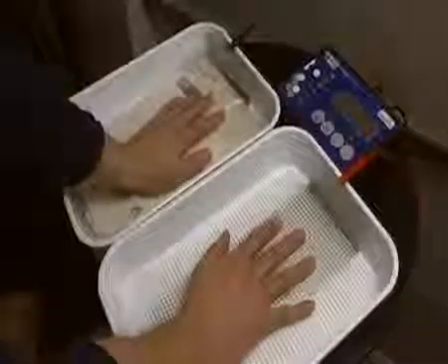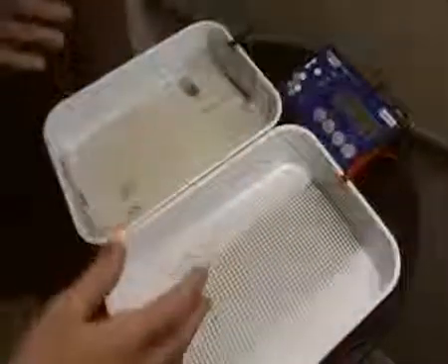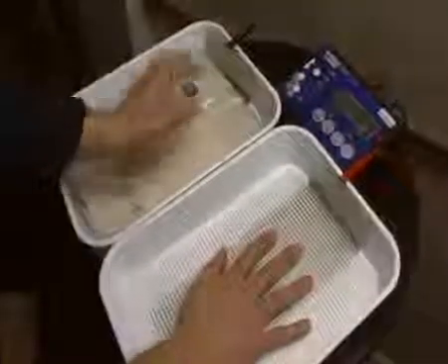If you need to answer the phone, you can take your hands out — there's circuitry in there that will protect you from getting a static shock. Put your hands back in and it'll remember where you were, what power settings you had, and resume from the same point to stop any kind of over-treatment.